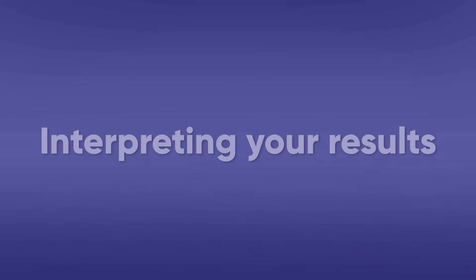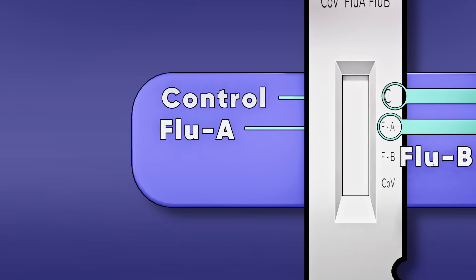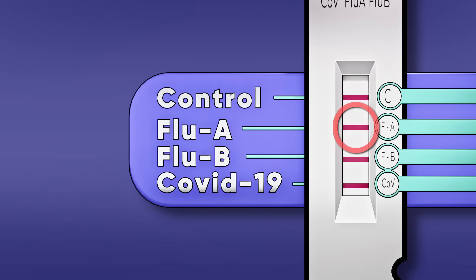Interpreting your results: Look for lines next to C, FA, FB, and COV. C is the control line, FA is the Flu A test line, FB is the Flu B test line, and COV is the COVID-19 test line. A red line should always appear at the C position — this is the control line and signals that the test is working properly.